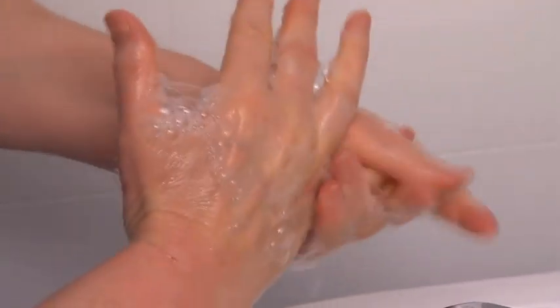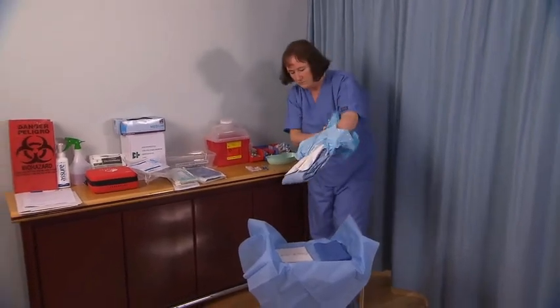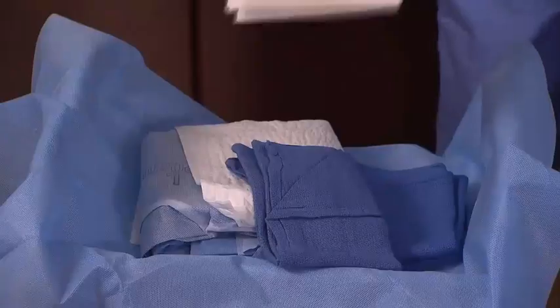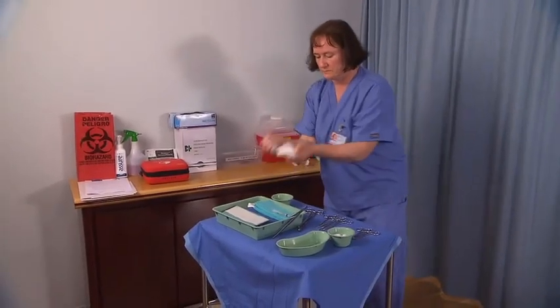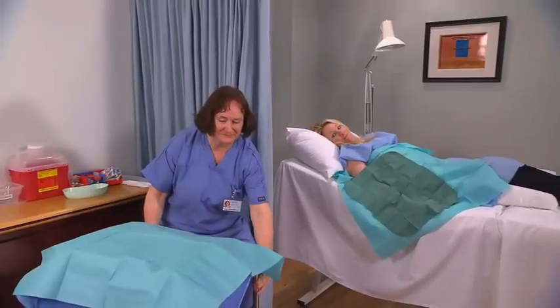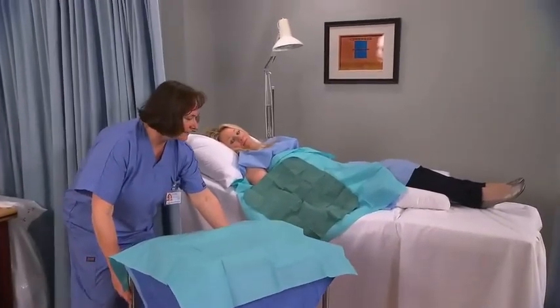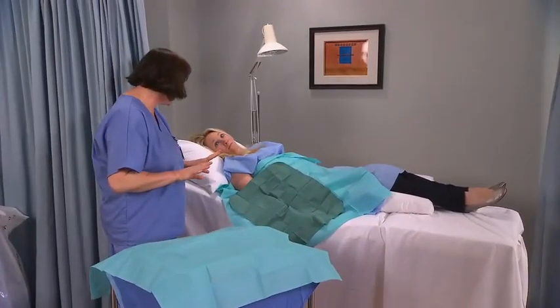Wash your hands. Assemble and prepare the equipment required for the procedure. Set up a sterile field, remembering to use sterile technique to avoid contamination. Position the instrument stand near the patient and instruct the patient not to touch anything in the sterile field.